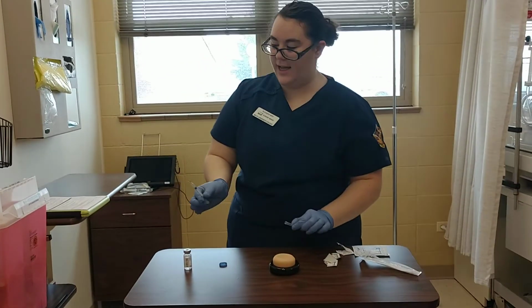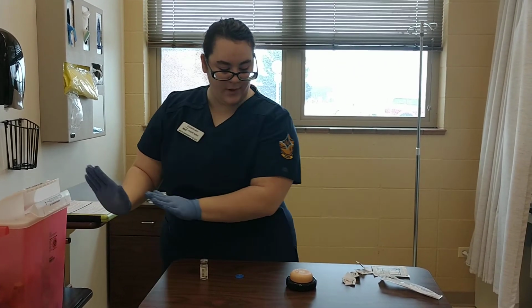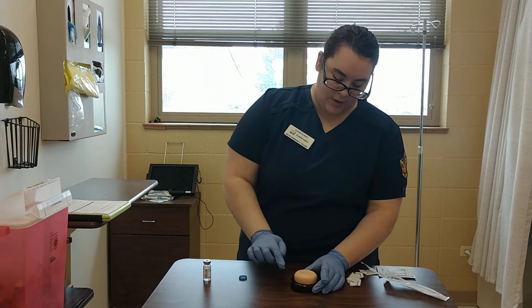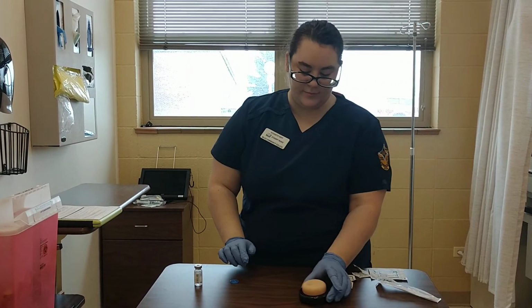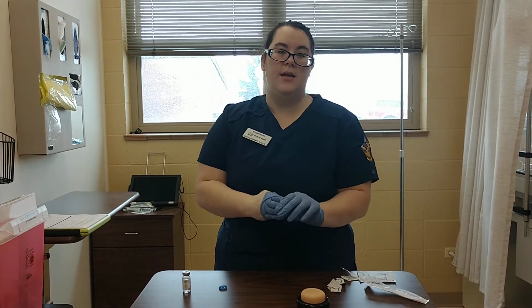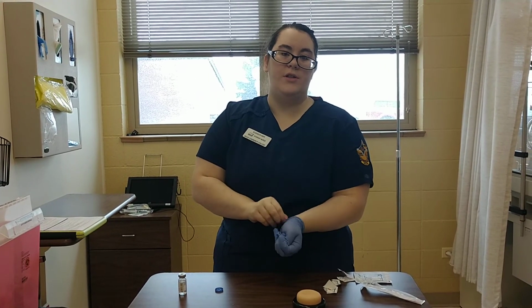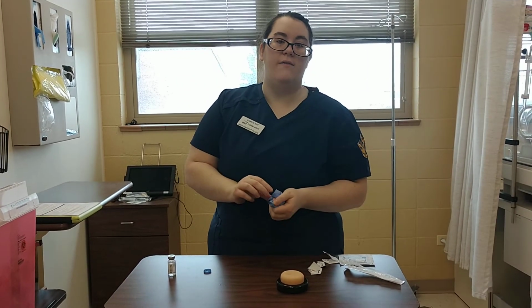I am not going to recap the needle. I'm going to put it directly into the sharps container. And I'm going to draw with a pen a 1-inch circle around the wheal. And I'm going to document in the MAR and the nurse's note the time, date, and location of the injection.